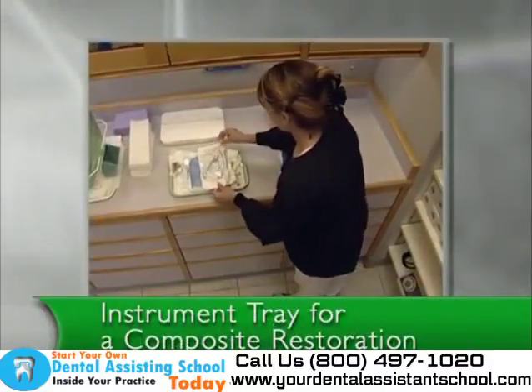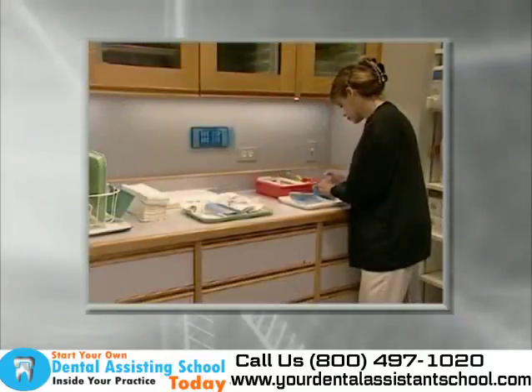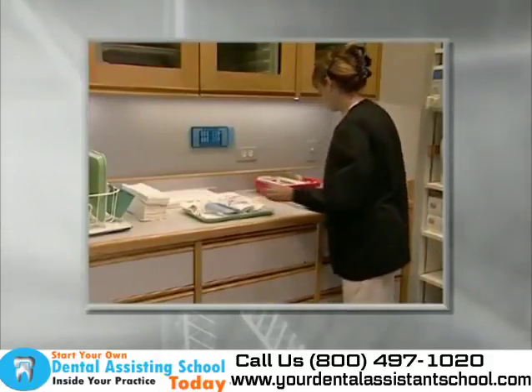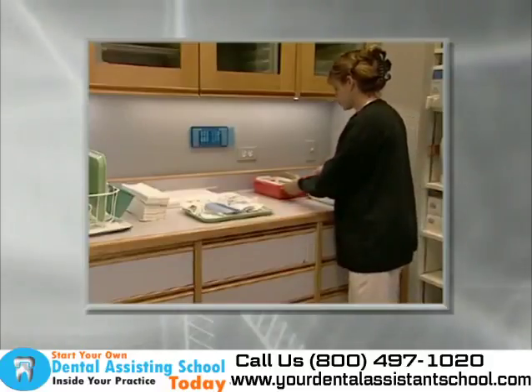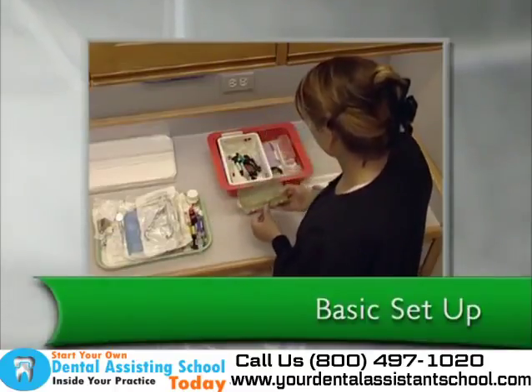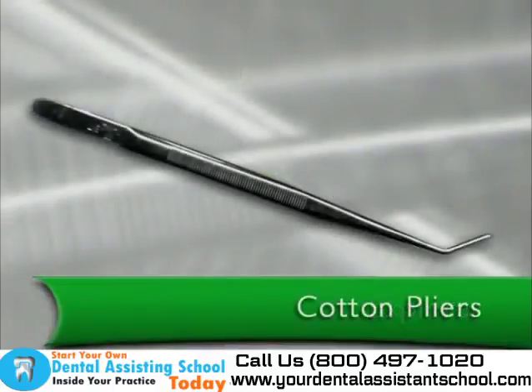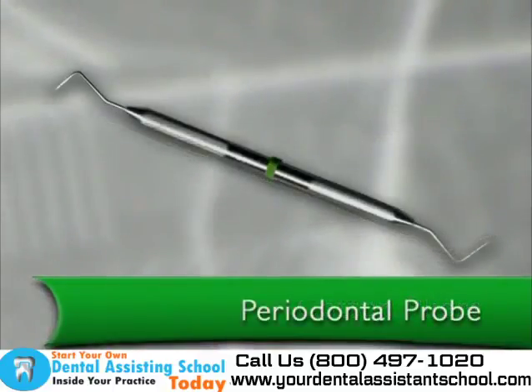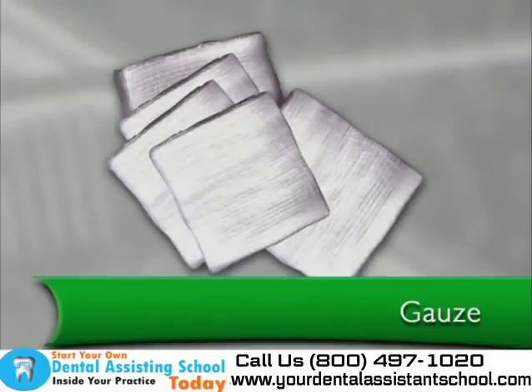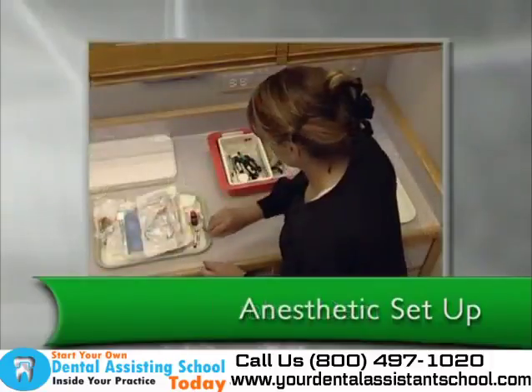One of the most utilized trays in general dentistry is the composite tray. A composite restoration tray contains several different setups and instruments. The instruments and setups may vary depending on the dental staff and dentist preference. A typical composite restoration tray would include the basic setup with a mouth mirror, an explorer, cotton pliers, a periodontal probe for measuring gingival sulcus depth, and gauze for retraction and absorbing excess moisture. The rubber dam setup. The anesthetic setup.